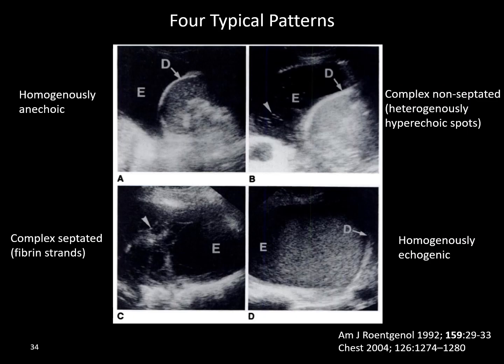Ultrasound is excellent at characterizing the nature of pleural effusions. In general, transudates are anechoic. Anechoic effusions can be either transudates or exudates. Complex septated or echogenic effusions are exudates and should be further evaluated in febrile ICU patients. Echogenic effusions are typically hemorrhage or empyema.